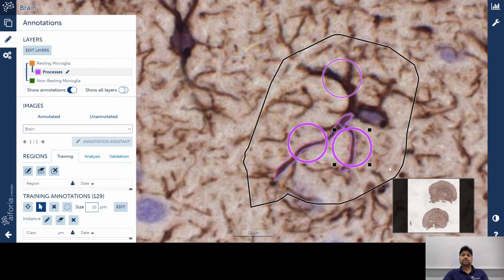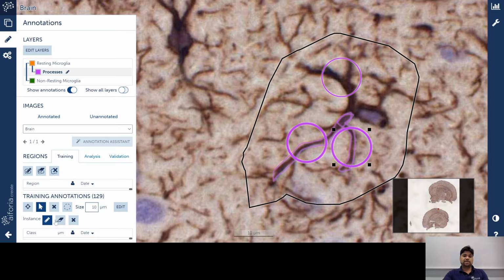With this, now we are done with the annotations, and of course, we need to also do the annotation for the last object of the process. It's not always necessary to draw all the instances for all the objects, but you can draw at least 10 to 15% of the total number of objects that you have. So it reduces your annotation time as well.